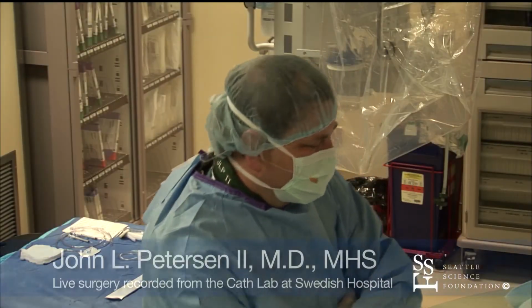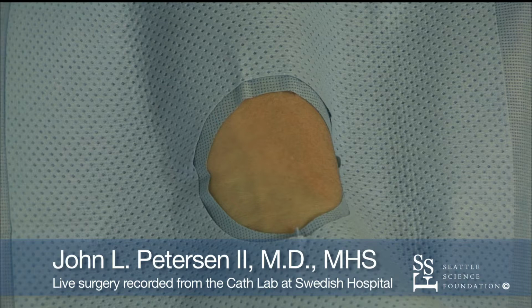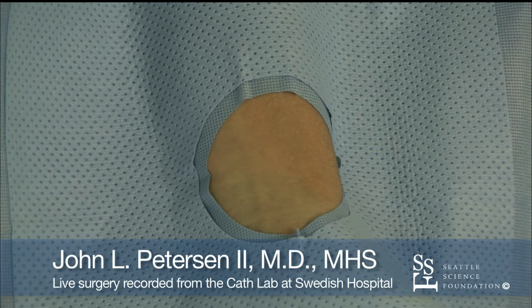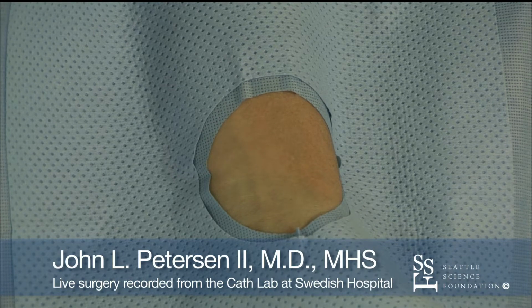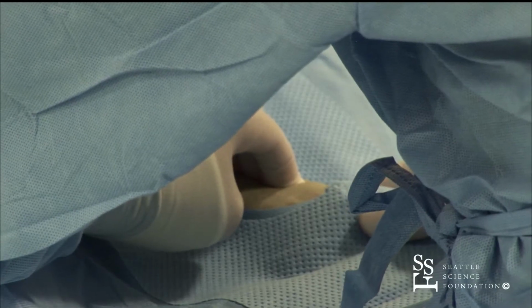So what we've got here is, if you see over here, the left wrist has been prepared, and we're going to get going, okay? And we'll show you the techniques, or I'm sure Jeff's trying to talk to you a little bit about that. What I've been doing is usually a front wall stick, and Jeff will show you the double wall stick here, and we'll get going.